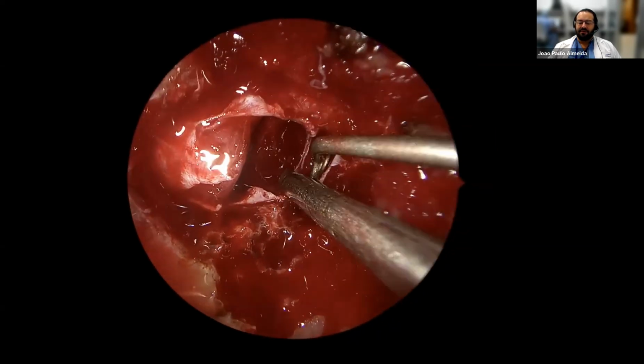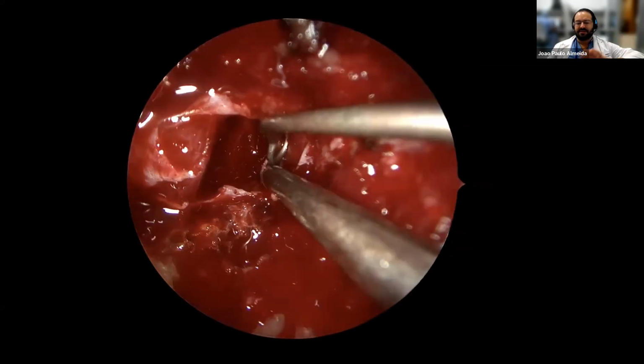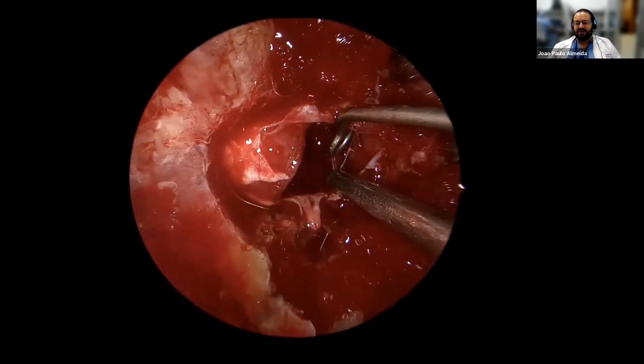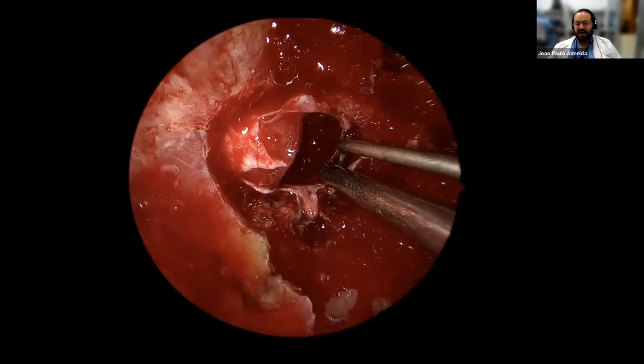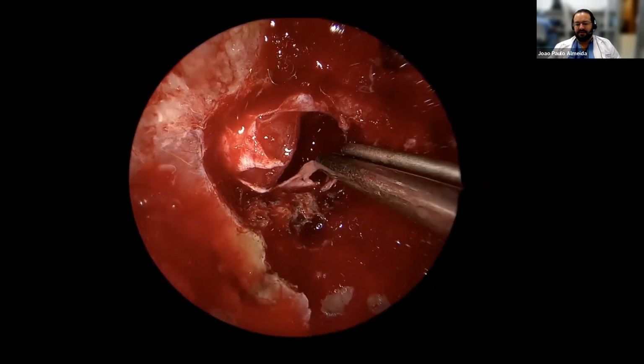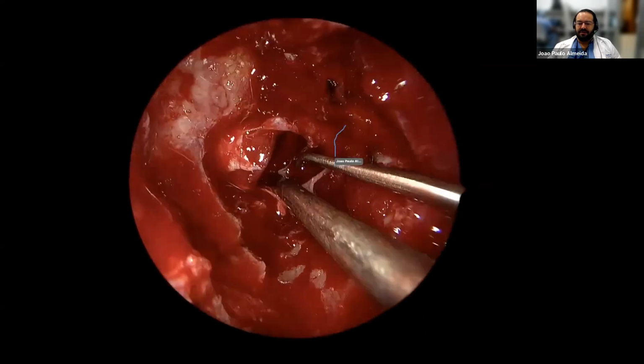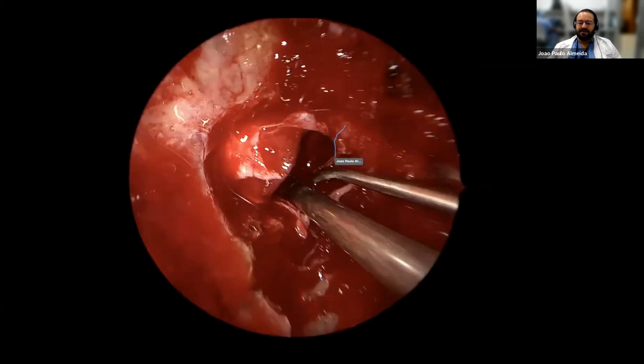Now I'm transecting the medial wall. So you see dissection from lateral to medial. And it's interesting because this is being done with a 30-degree scope, which is usually not what we do, but this is the angle that was required. And then as I dissect this medial wall, as you see here, we can see the carotid fully exposed here.